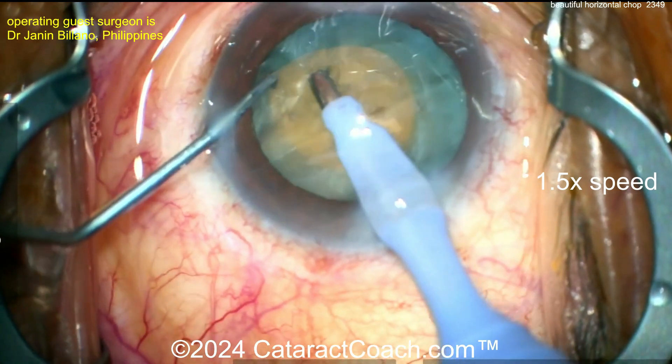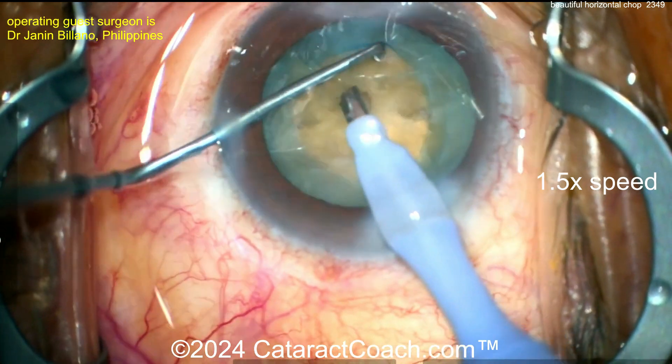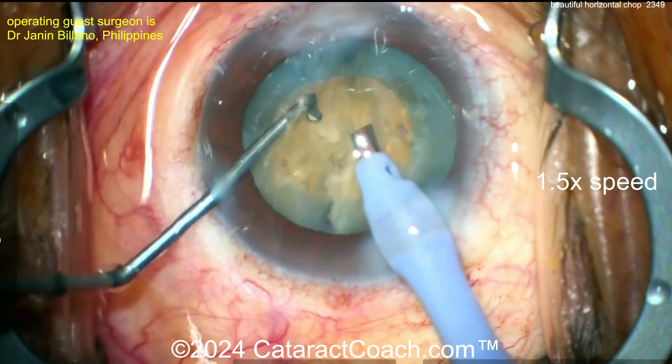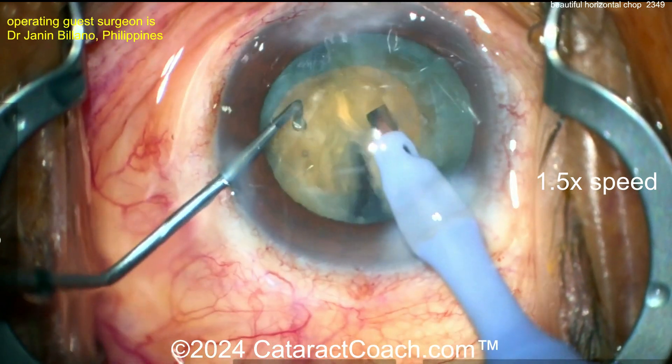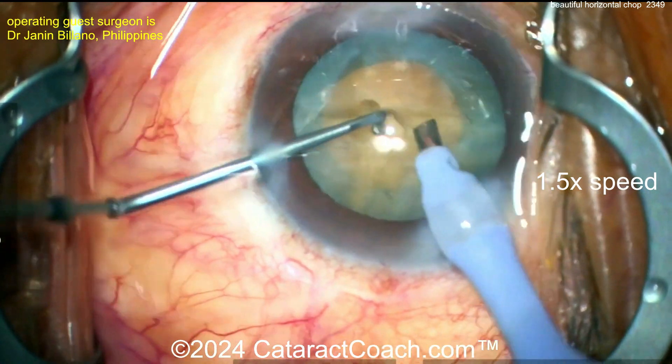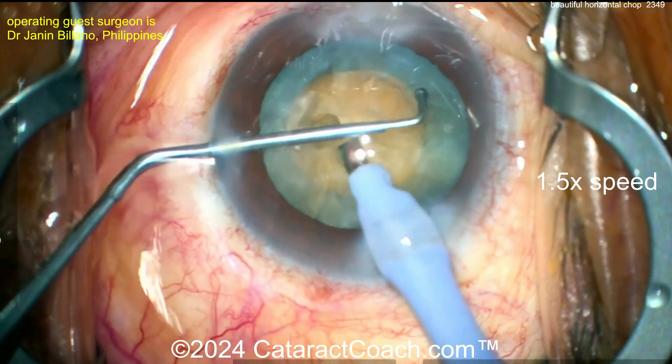A few chops have been done, but the catch is — look back there — I don't know if they're all fully separated just yet. You want to separate the pieces out a little bit more. You see they're still kind of fibrous and still attached, so you won't be able to bring them up. See that attachment point there — exactly, you want to separate that. So it's buzzing again with the FACO probe.